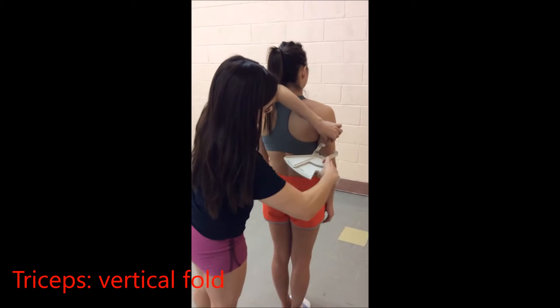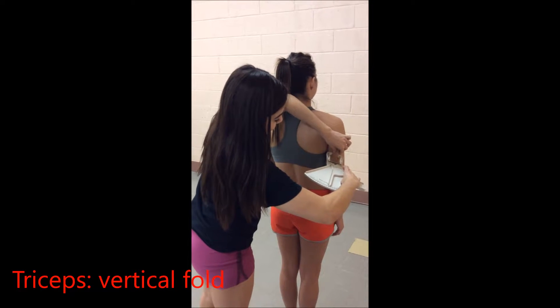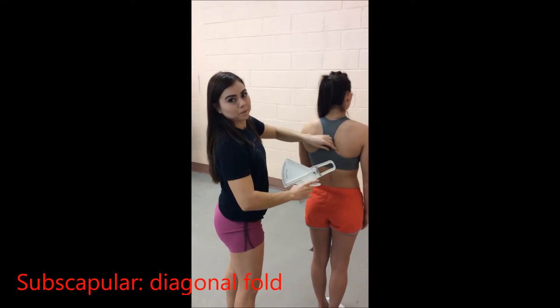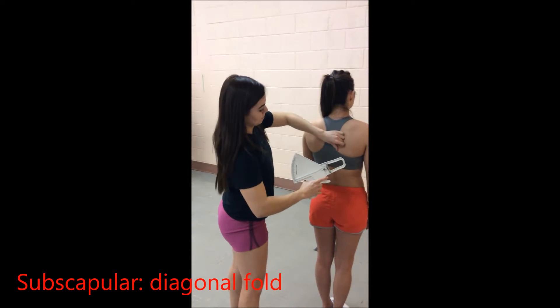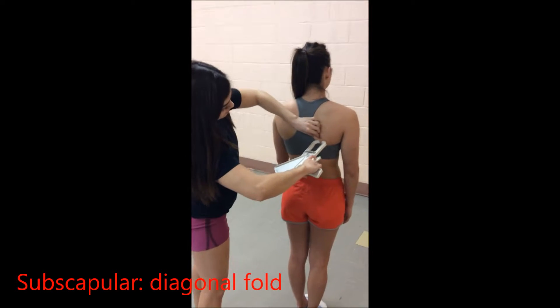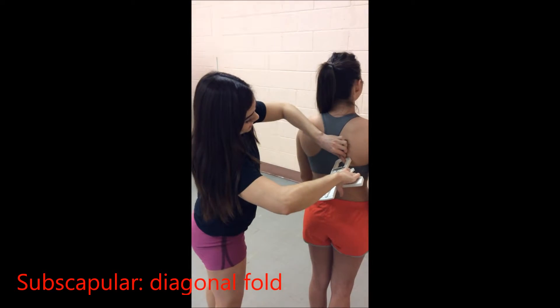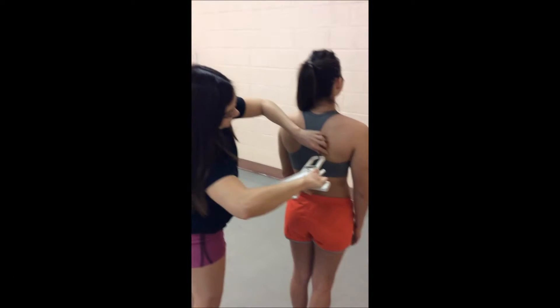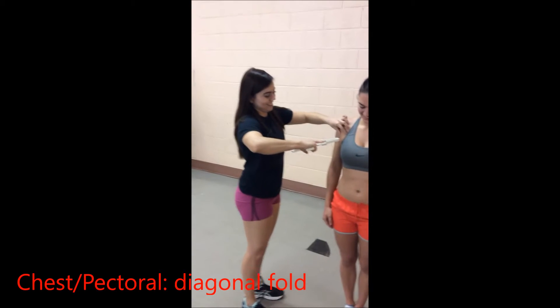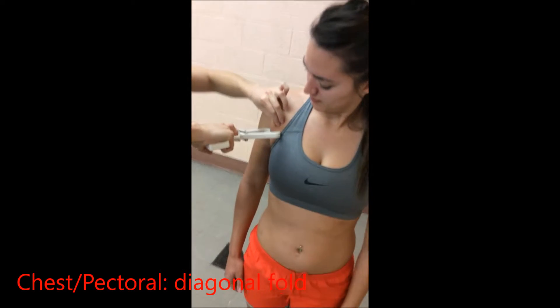Firmly grasp the skin fold between the thumb and the index finger of your left hand, 1 cm above the site to be measured. Pull the skin fold up and away from the body. Keep the fold elevated while you take the measure, and keep pinching the fold with your left hand throughout the entire measurement.